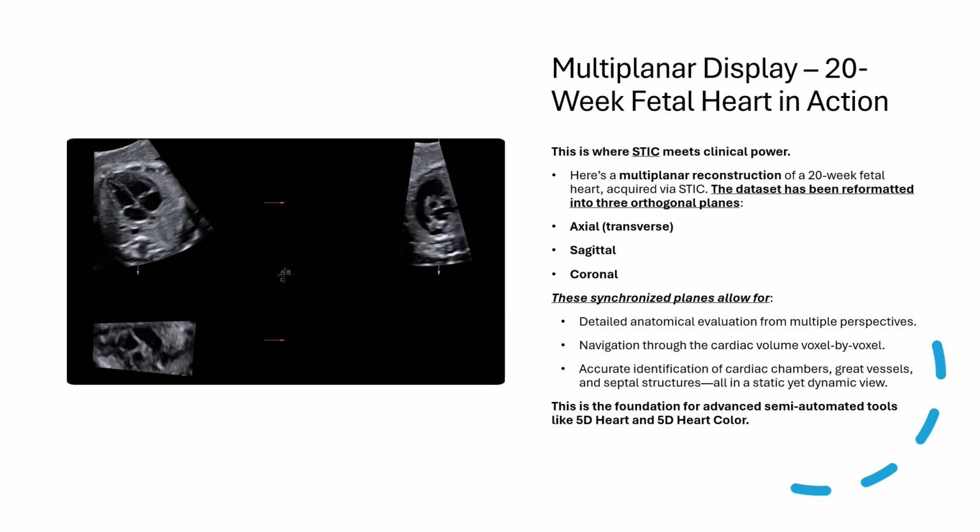This feature of STIC technology forms the bedrock for more advanced automated tools like 5D Heart and 5D Heart Color, tools that further enhance our diagnostic capabilities by streamlining the identification process. This multiplanar approach gives us a comprehensive multiple angle view of the fetal heart, which is invaluable for both routine assessment and more complex evaluations.